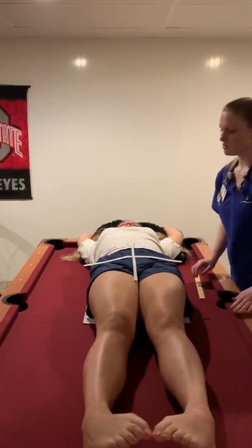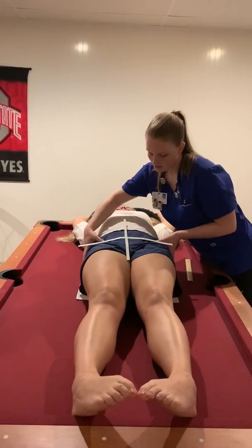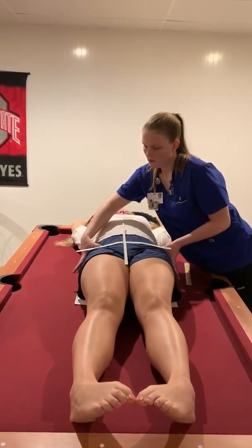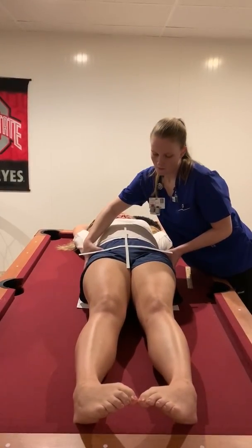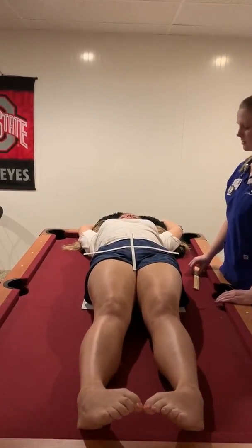And now I'm going to make sure there's no rotation. I could check for rotation by making sure that the ASIS are equidistant from the IR, and it looks like they both are. So she's not rotated.